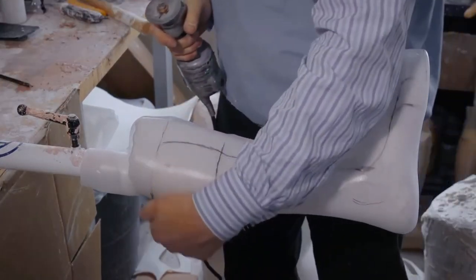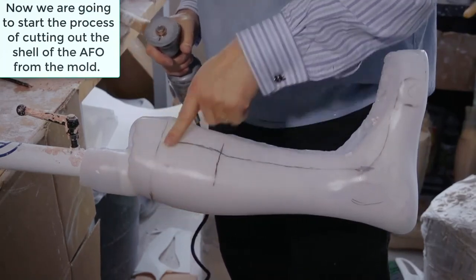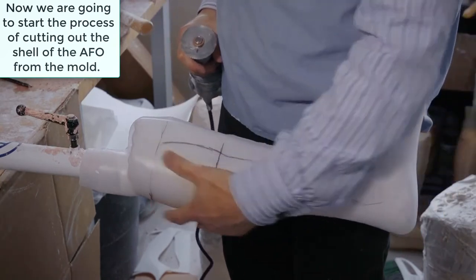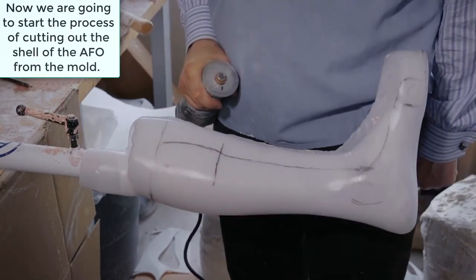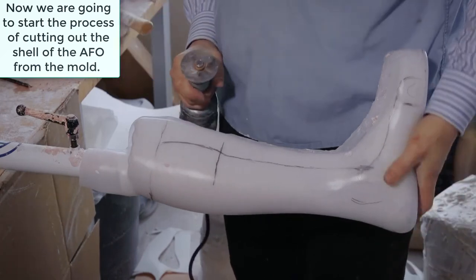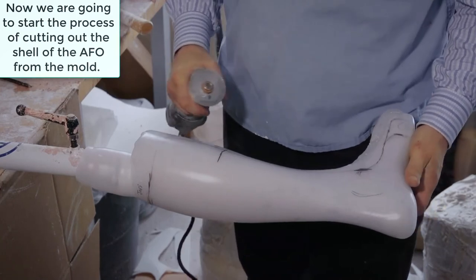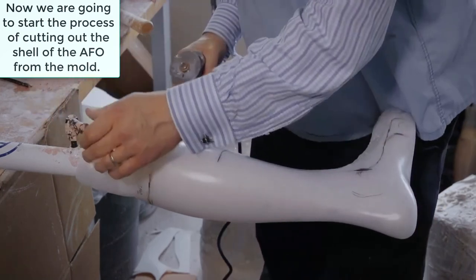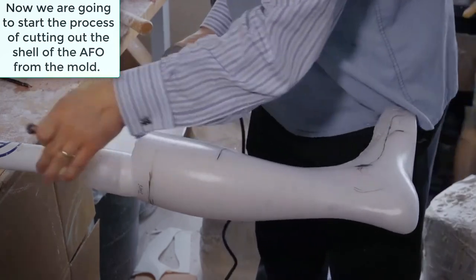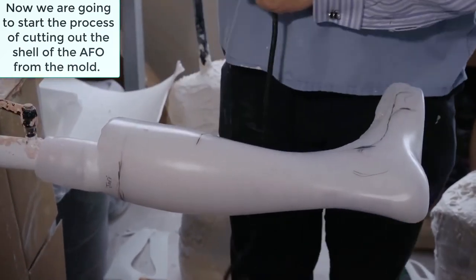Now I'm going to start trimming this out. Okay, this would be the trimming out process. Now we just drew our lines on this before to kind of get a feel of the shape that we want. You never want to just cowboy it and, I suppose, just start cutting on this. Even after the years that I've been doing this, I still like to draw them out. So we're going to tighten up our vise here and get started.